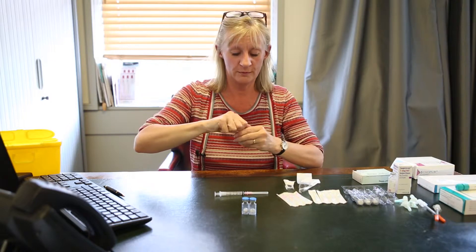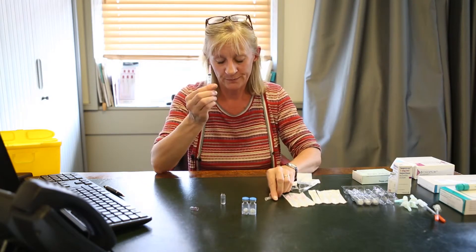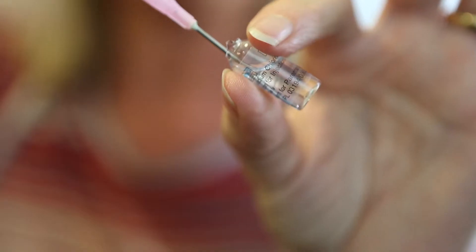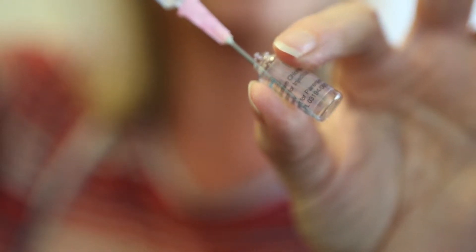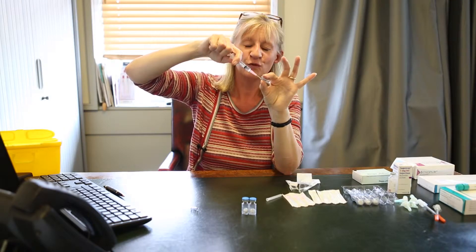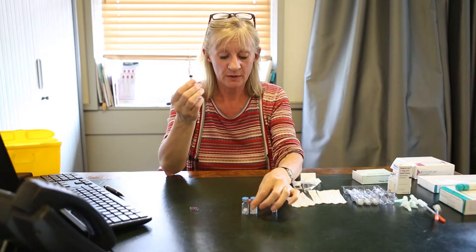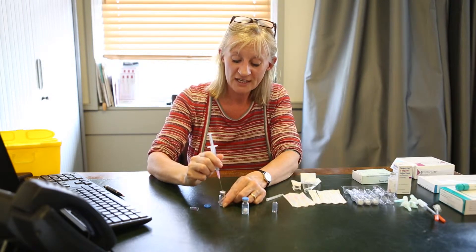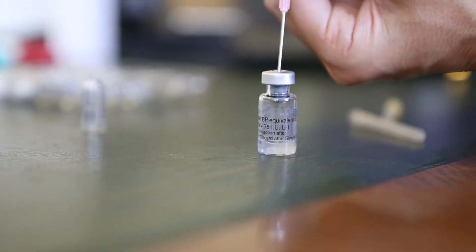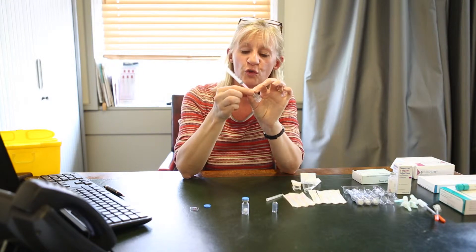You'll then need to break off the top — it's not always easy. You are then going to draw up that 1ml of fluid. You will see on the pink needle that it is beveled, and you need to angle that down into the fluid to make sure that you withdraw all of it. This may take some practice — don't worry. If you haven't got it all, just push it back in and withdraw it again. If you've left a few drops of fluid in the bottle, do not worry. You've then got your fluid in the syringe. Take your Menopur ampule, take off the top, and inject that fluid into there. As you can see, it dissolves very, very quickly. Give it a small shake, and then draw that fluid back up into your syringe.